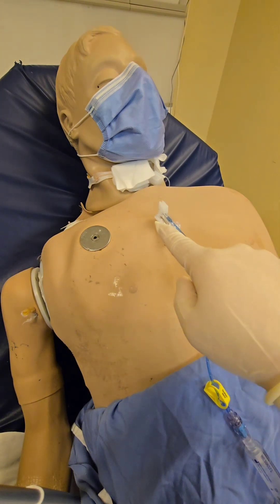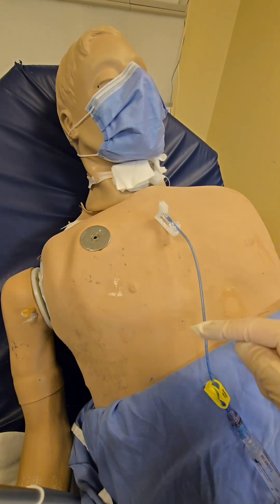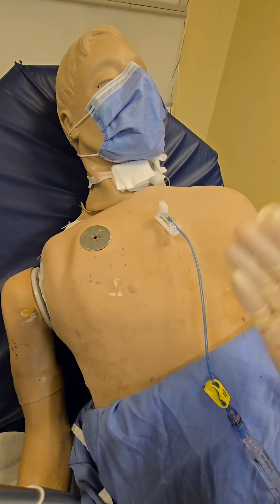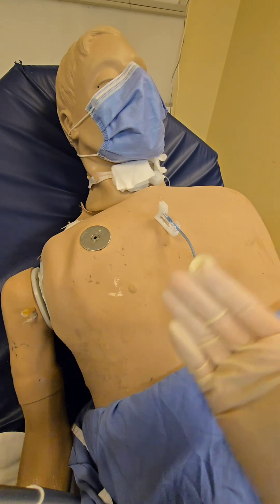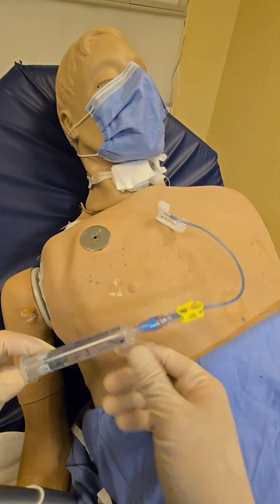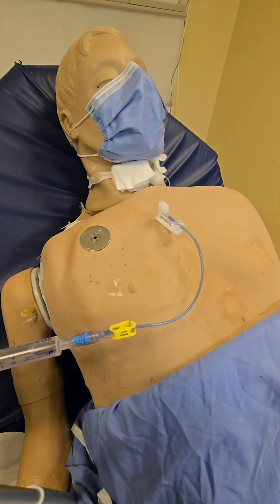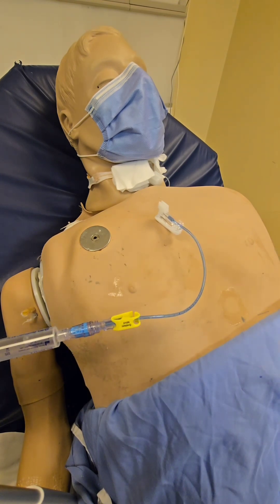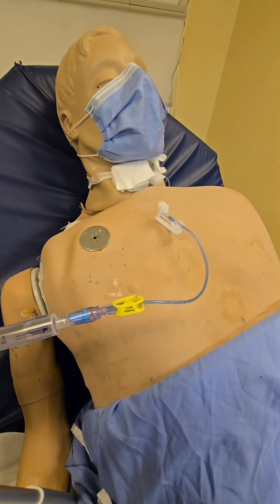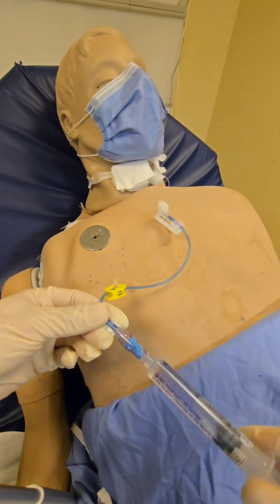Now that the portacath is in, there is a slight variation depending on your hospital. Some hospitals allow you to flush the heparin into the patient — assuming the patient has no sensitivity to heparin, is not at risk for heparin-induced thrombocytopenia, or has no other contraindication. Some other hospitals require you to waste about 5 cc's of blood first to get rid of the heparin inside. Our institution allows you to flush the heparin in because it's at a very low concentration — 100 units per milliliter — so we are just going to flush.